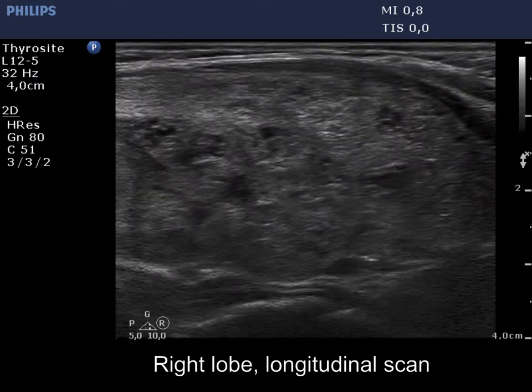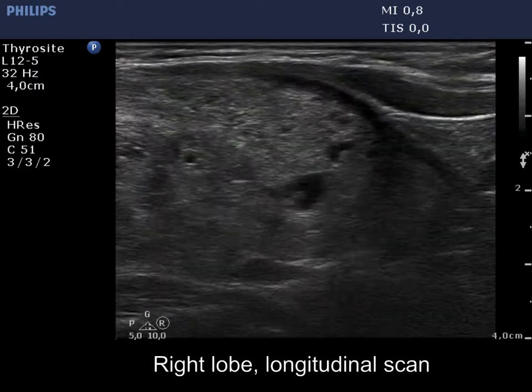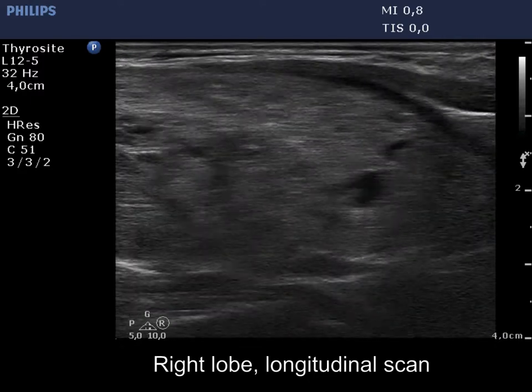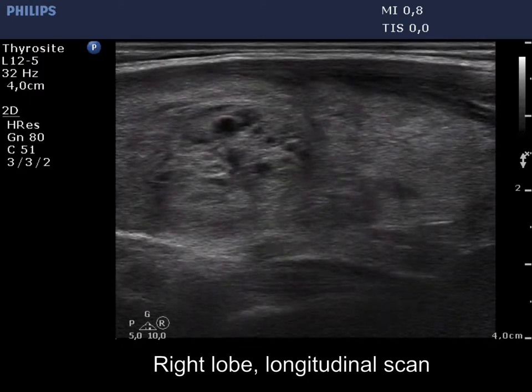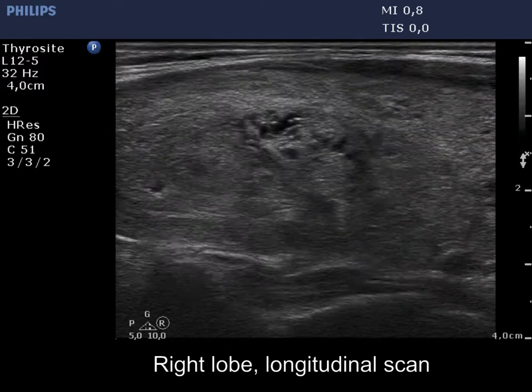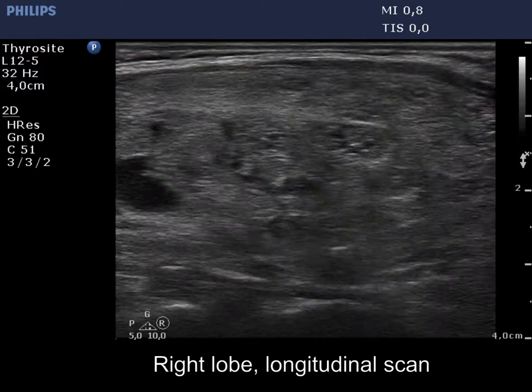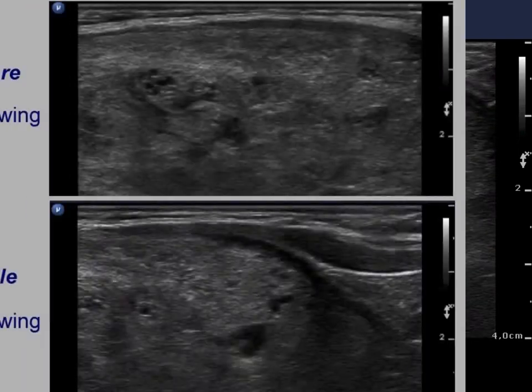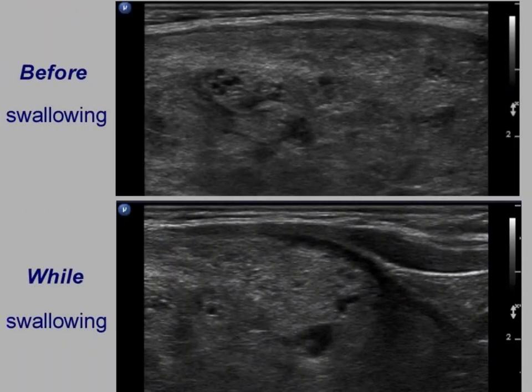Before swallowing, while swallowing — the upper image demonstrates the position before, while the lower one shows the movement while swallowing and when the lower pole came into sight.